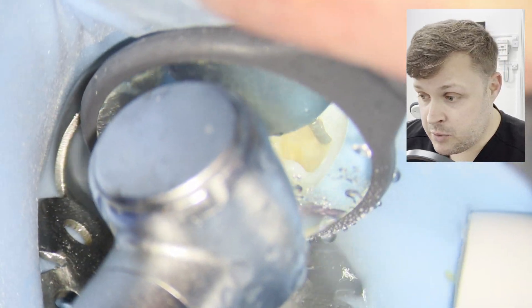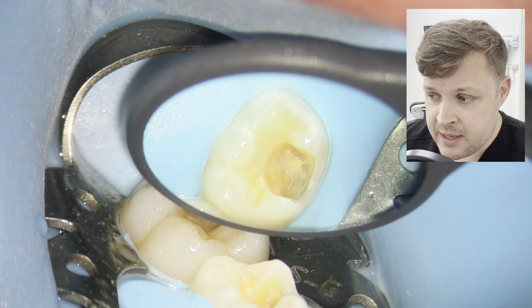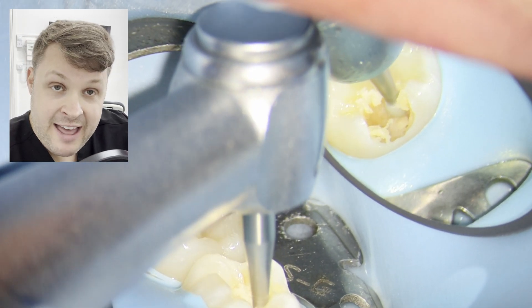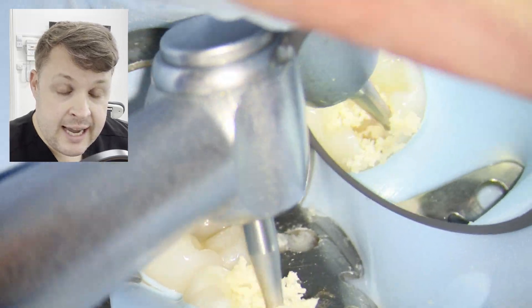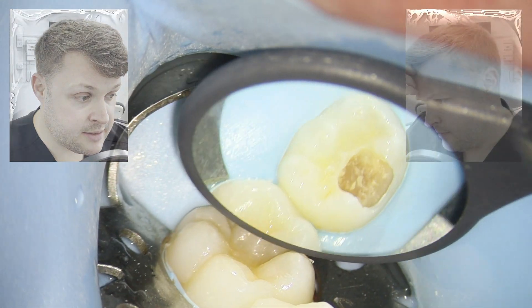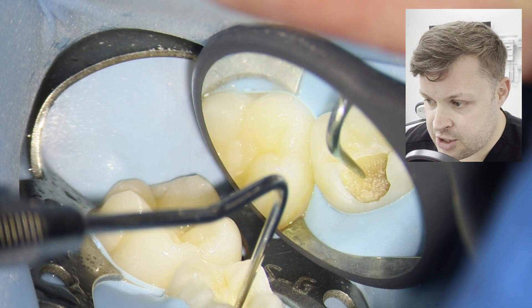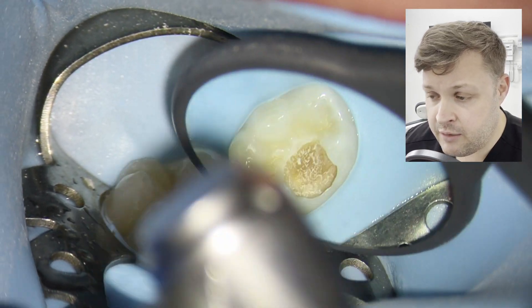Now I'm using a slow handpiece with a size six or size eight rose head burr. I'm going around the edges of the cavity — I don't want to put the rose head exactly where the pulp might be, so I'm being really careful. I'll check the base of the cavity for decay and if I have to leave decay above the pulp I will, and that's a conversation to have with the parents. I'm having a scratch and I think there is still decay at the base of this cavity.